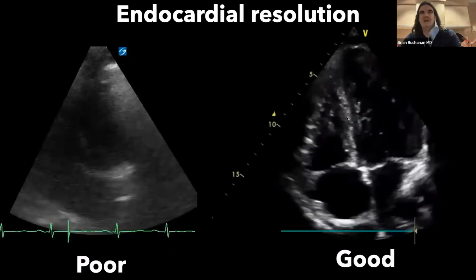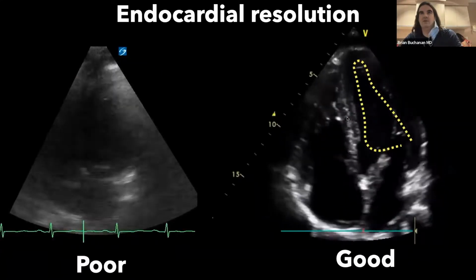So there's just an example of drawing on the inside of the LV where the endocardium is.